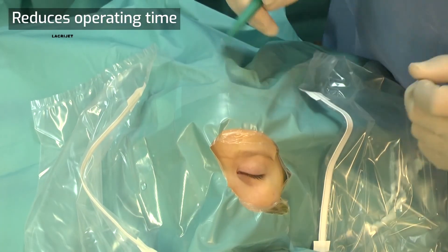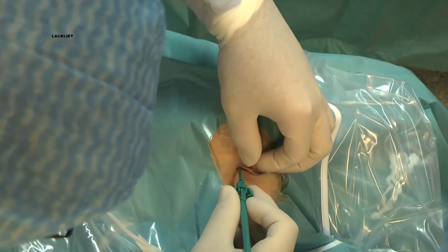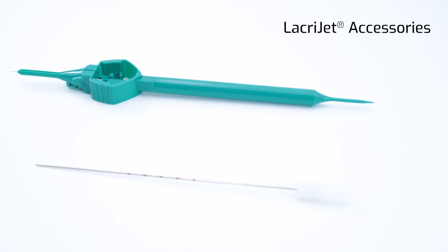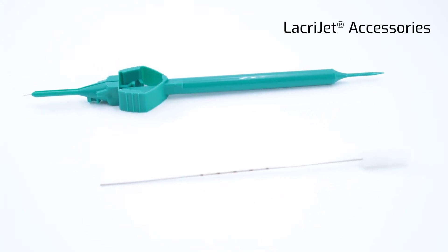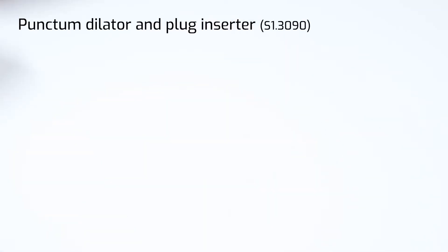LacryJet has been specifically designed to reduce operating time both in the intubation phase as well as during the removal of the device. LacryJet requires the use of a sizer to select the correct length, and a disposable punctum dilator and plug inserter to seat the plug.